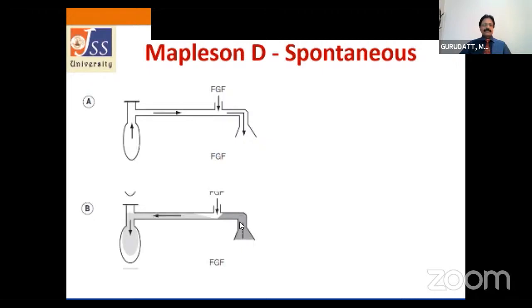During expiration, the dead space gas and alveolar gas start moving. In the meantime, the fresh gases are also pushing these expiratory gases, especially the dead space gas and the alveolar gas, towards the bag. Unless the fresh gases are in sufficient quantity, these gases may not reach the bag. So when the patient takes a breath, the patient may be breathing the expired or alveolar gases.